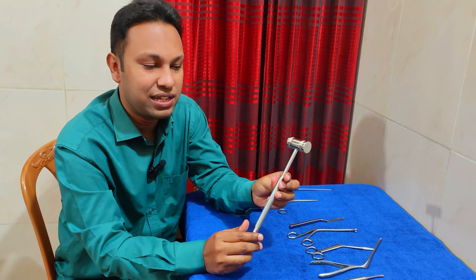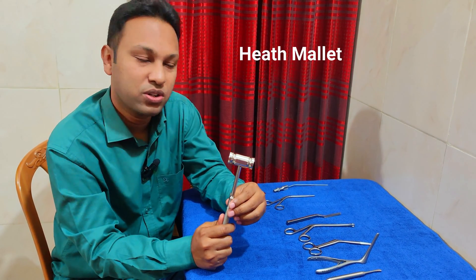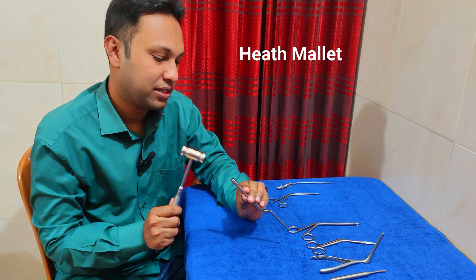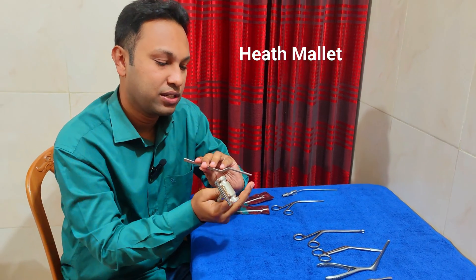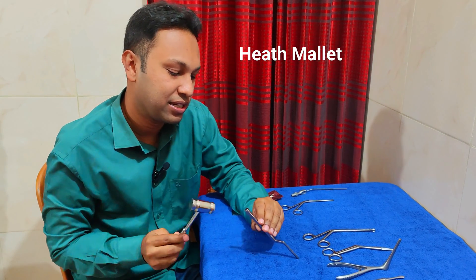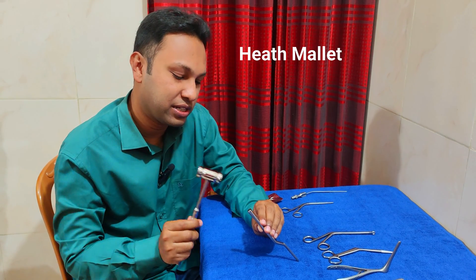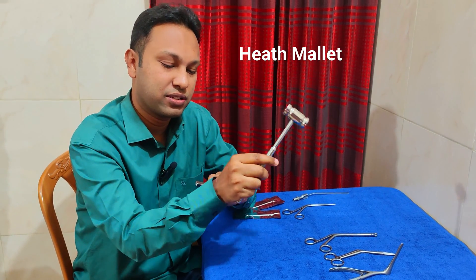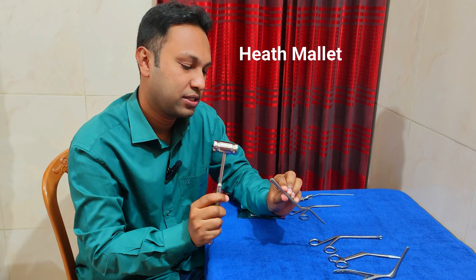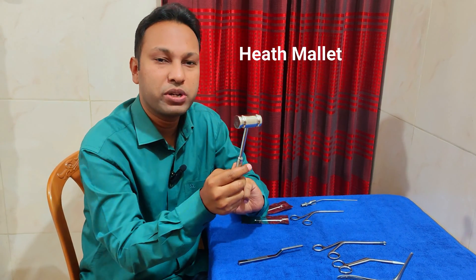This is known as the Heath mallet. It looks like a hammer and is used over the gouge. First, the V-shaped tip of the gouge is engaged into the maxillary crest, then the mallet is hammered over it with the movement of the wrist only — with a swift movement of the wrist.